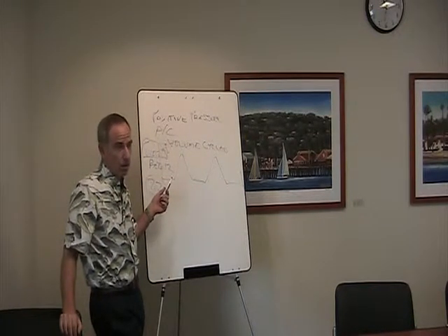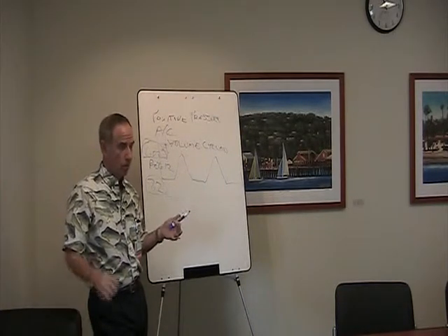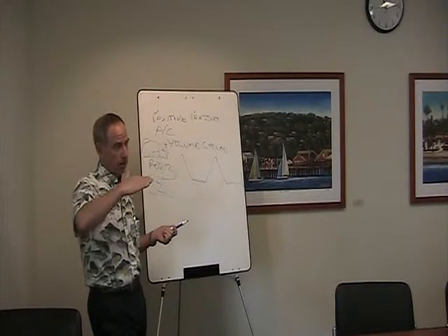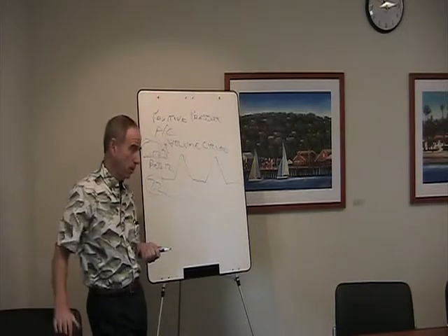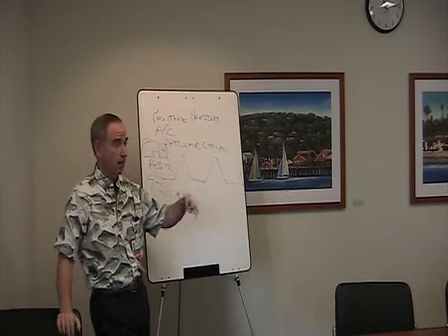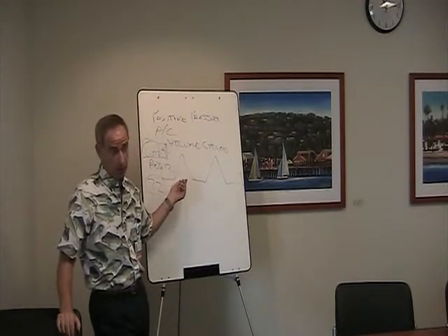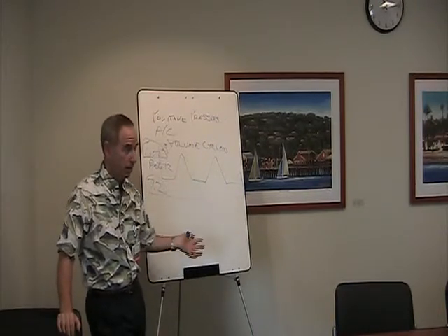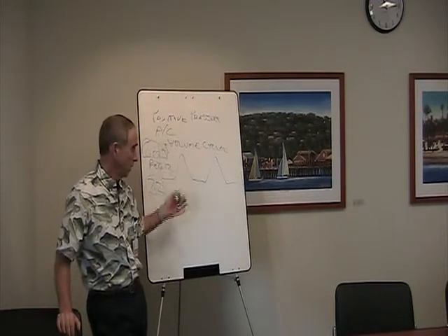Set a max pressure that it can go. Right, so you set a maximum pressure, a pressure limit. And how does that work? Well, there's what's called a pop-off valve, where once that limit, that pressure that you've set, is exceeded, the valve pops open and it releases the excess pressure just into the air. So it protects the patient from seeing any more pressure than what you've set as a maximum. So if you set it at 40 centimeters, it'll never go above 40. It won't get the volume either for that breath, right? But an alarm will go off telling you that the pressure limit is exceeded. So you know there's a problem at that point. Okay, so the same thing with compliance.